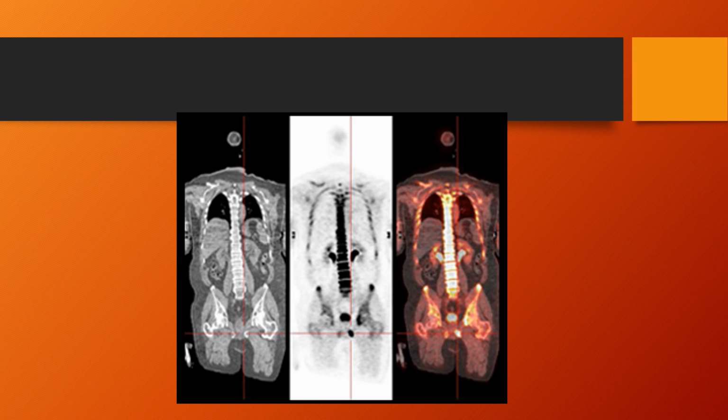However, MDP is still the scanning method of choice. Not by choice, really, I shouldn't say that, but it's the one that's still a lot more common than sodium fluoride bone. A lot of that has to do with the availability of the sodium fluoride bone scans, but most of it has to do with a lack of reimbursement, and insurance companies, even though it's less radiation, it's better on the patient, all around just better in so many ways.